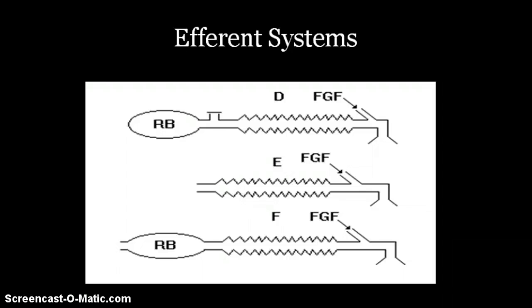The Mapleson D, E, F, and Bain systems include a 6 mm tube as the afferent limb that supplies the fresh gas from the machine. The efferent limb is a wide-bore corrugated tube to which the reservoir bag is attached, and the expiratory valve is positioned near the bag. In Mapleson E system, the corrugated tube itself acts as the reservoir. In Bain's system, the afferent and efferent limbs are coaxially placed.